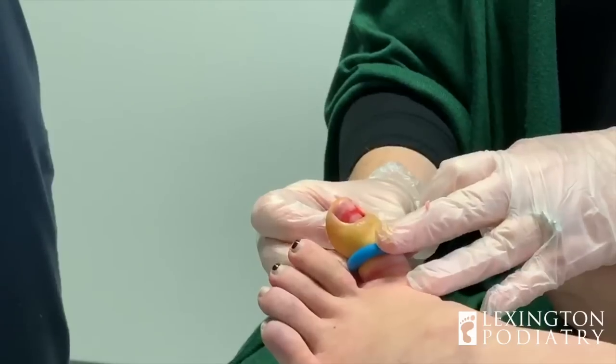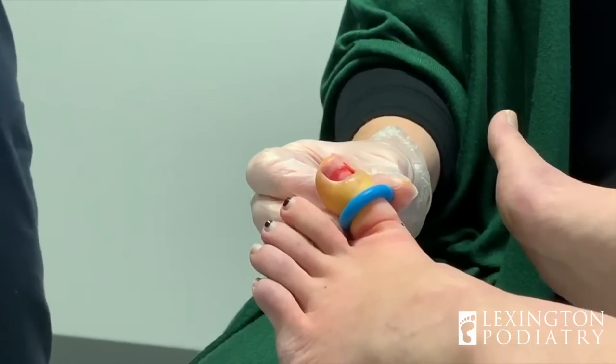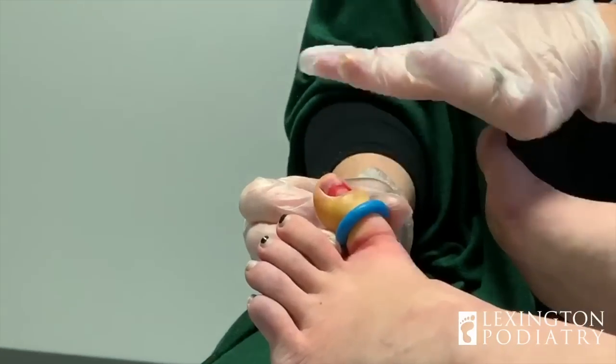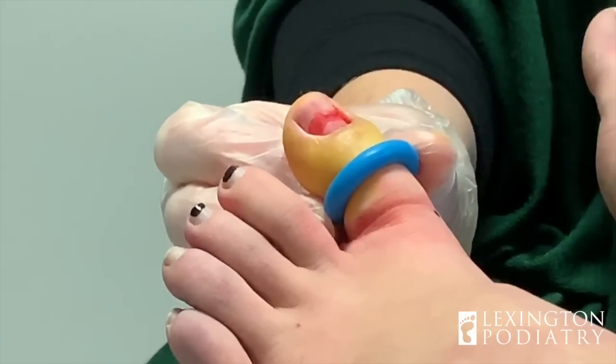So what's going to happen is tomorrow it's going to be bloody and the dressing is probably going to be stuck to it. But that's okay — you'll just soak it and it'll come off. This will just fill in and it'll be nice and flesh colored. And then a nail will just start to grow right in within a few months.